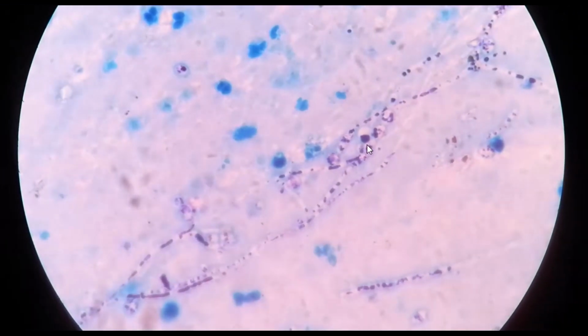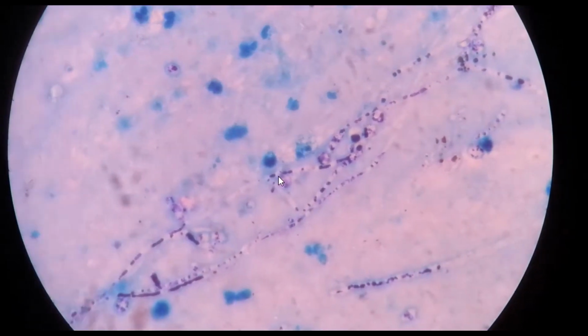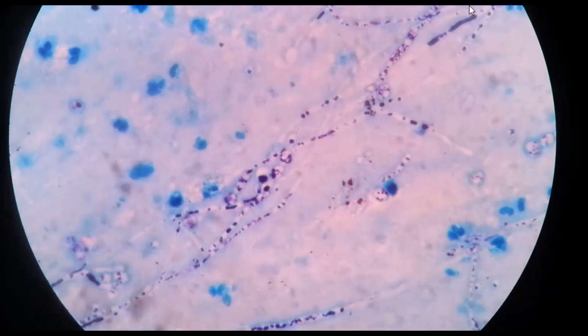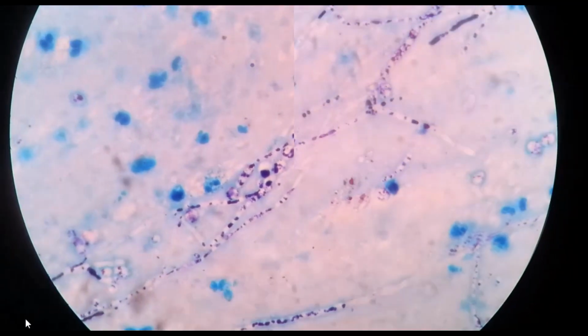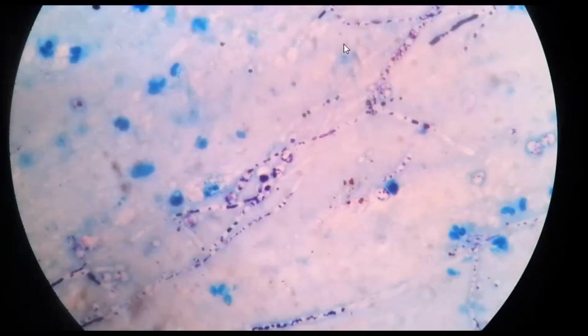Here you can see nocardial structure. This is the zoomed view. Isn't it beautiful? This is the nocardial structure.